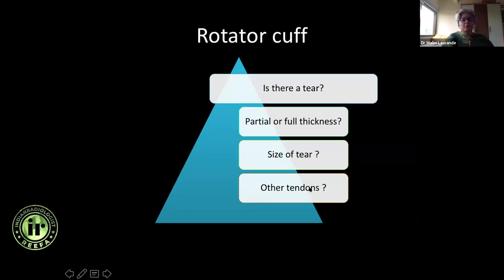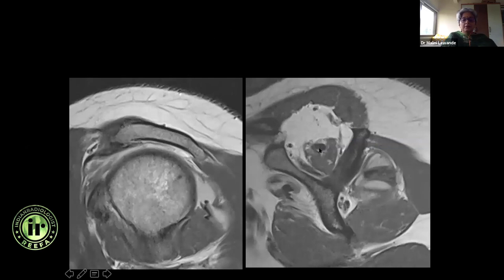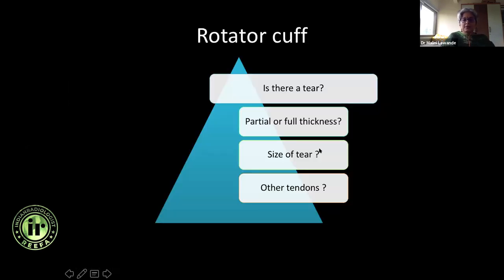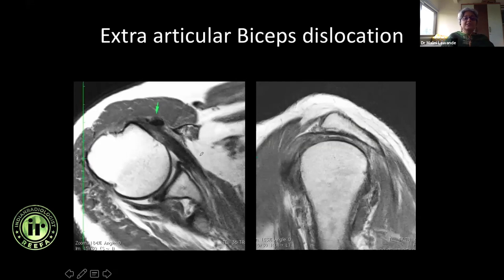Next question: what is happening to the other tendons? We are always looking at the supraspinatus, but remember the other tendons. Here, with a full thickness supraspinatus tear, the infraspinatus tendon is also torn and retracted. In this case, you can see there is no supra- or infraspinatus tendon at all.